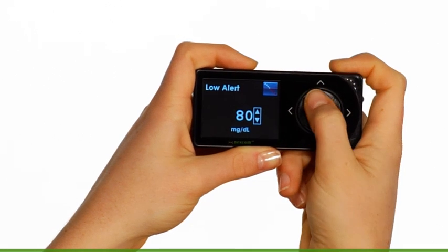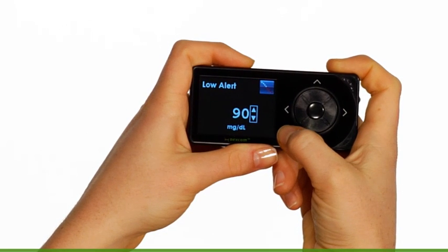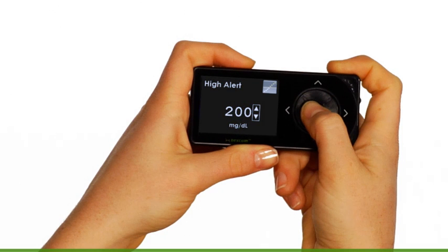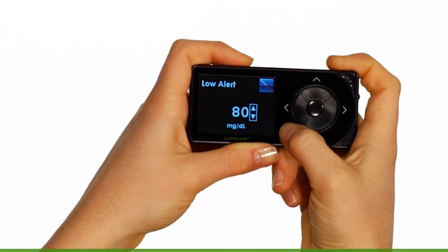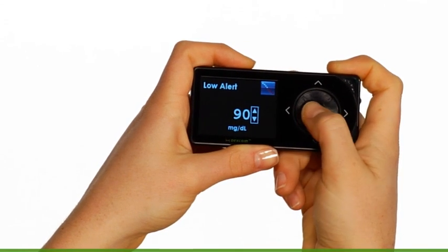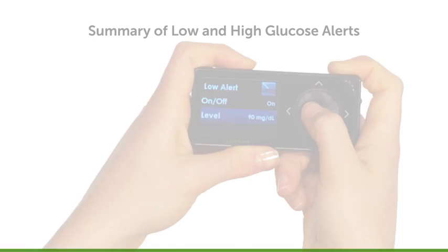To set your low glucose alert level, press the up and down buttons to adjust your low alert value. Press Select to accept this value. Repeat these steps to set your high alert value. As you use the Dexcom G4 Platinum system, you may need to change the high and low glucose alerts you initially set up. You can change or individualize these alerts whenever you want to, or whenever your healthcare provider suggests changing them, to best meet your needs.